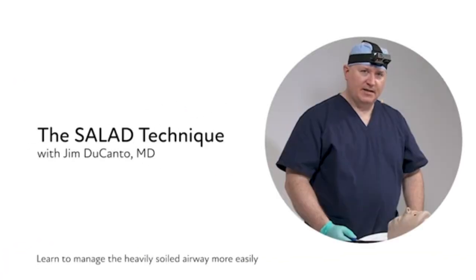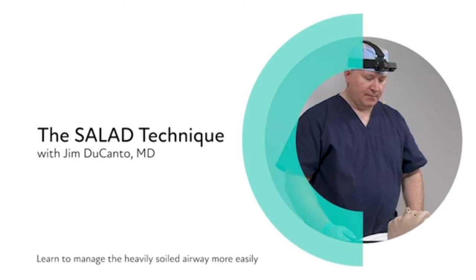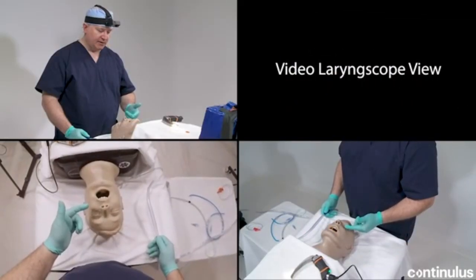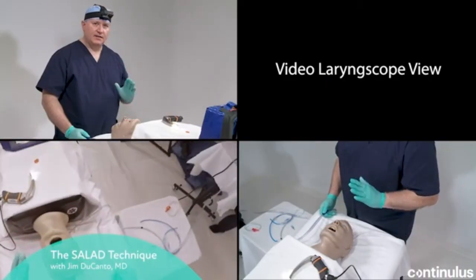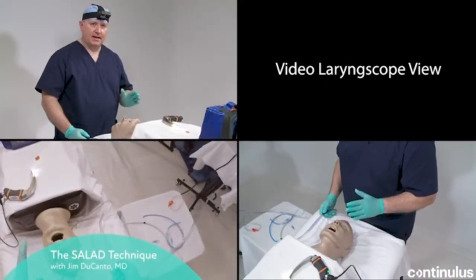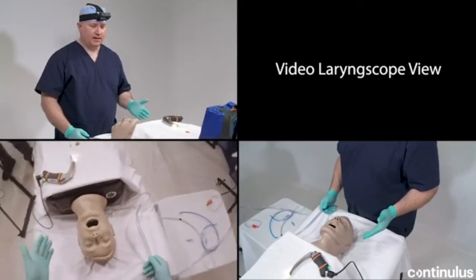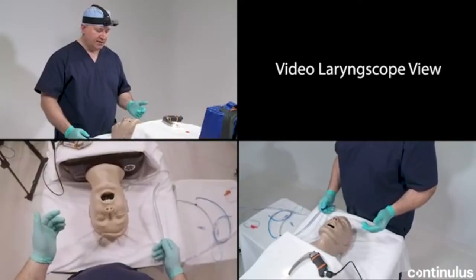We're going to demonstrate the basic techniques of SALAD here. My assistant is filling the mannequin with simulated airway contaminant. That's good enough, James. It's simulated airway contaminant made from a concentrate for artificial blood from the Simulaids NASCO company of the United States.